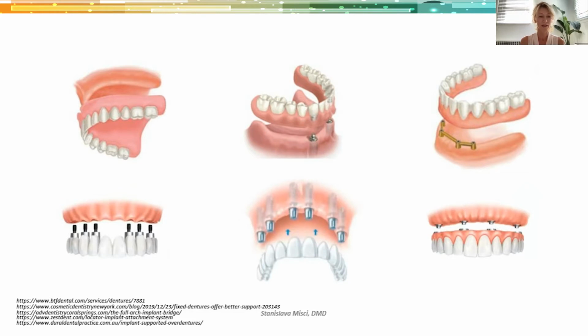We can have either a restoration that only restores the white portion of the tooth, the coronal structure, or one that restores both the coronal structure and the missing soft and hard tissues. We can have a prosthesis that goes directly to implant level and is retained directly to the implants, or prostheses that are attached to abutments, either prefabricated, custom abutments, or multi-unit abutments. And the prosthesis can be retained via screws or cemented.